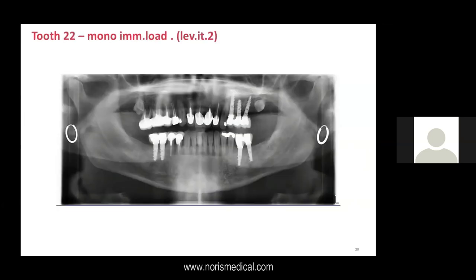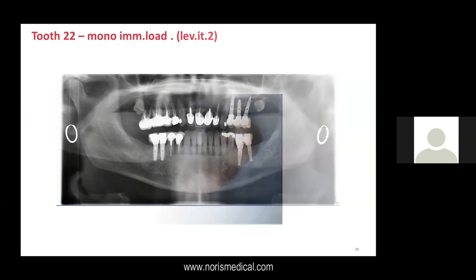So we're going to the mono, and what I'm going to show you actually, not in all cases, of course, I will show you the final results. For me to show you the temporaries are the most important things, because when the implant succeeds with the temporary, actually the final crown is not the issue here, but in most of the cases, I'll show you also a final result.